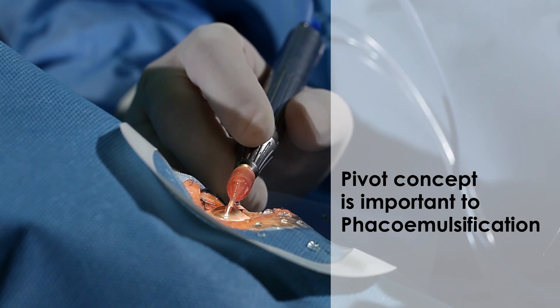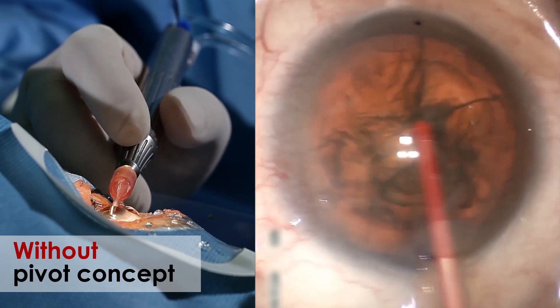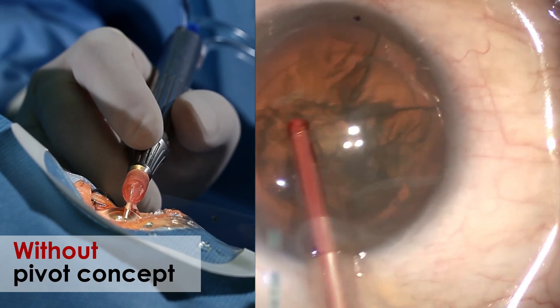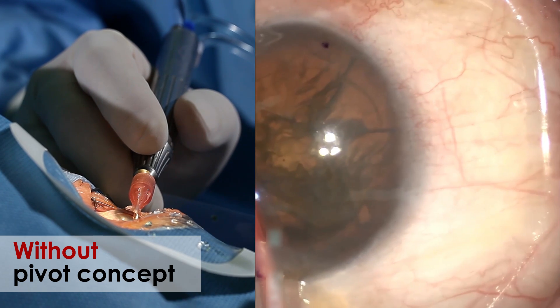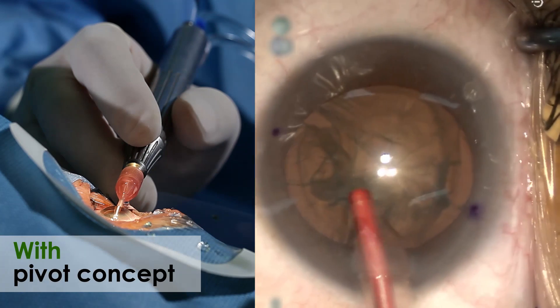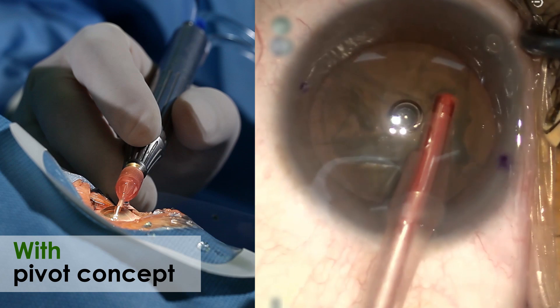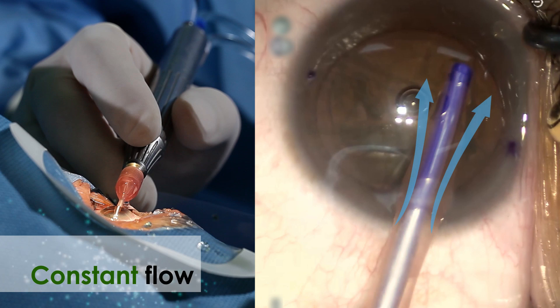In fact, the pivoting technique demonstrates excellent maneuverability not only in capsulorrhexis, but also with FACO probes and I/A tips. A burst of heat by ultrasonic energy can burn the cornea within seconds. With the pivot concept, during manipulation of the FACO probe, BSS stream can cool down the heat produced by the FACO tips.